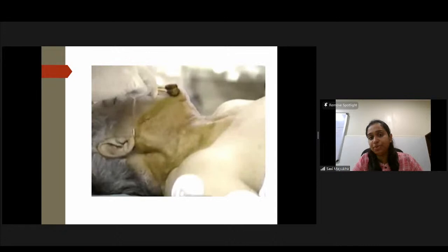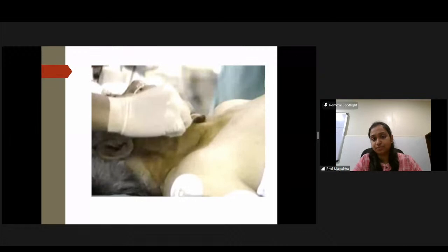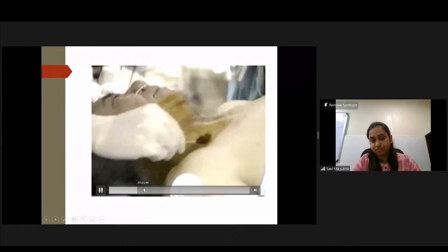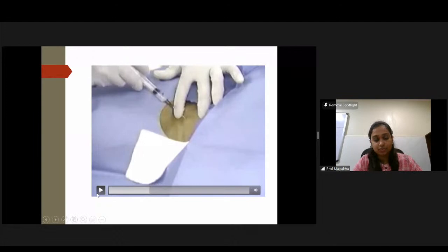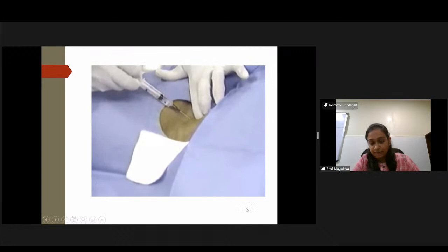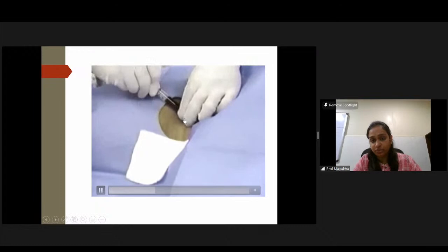You can make the sternocleidomastoid more visible by having the patient rotate his head to the contralateral side and flex his neck. Once the betadine is dry, place a sterile dressing on the patient. Then local anesthesia. As I was telling you, after this, you must maintain constant negative pressure while advancing. You can see they're giving local anesthesia at this place, and then they're locating the vein.